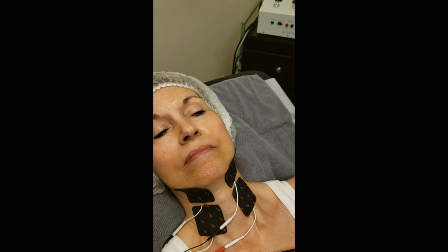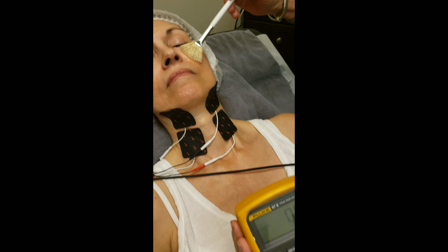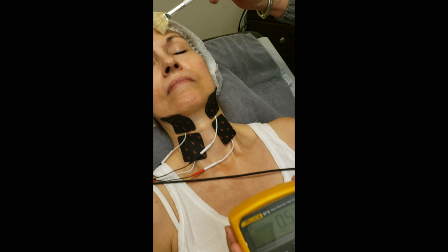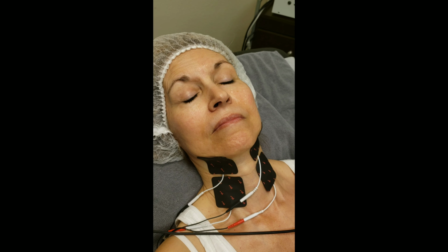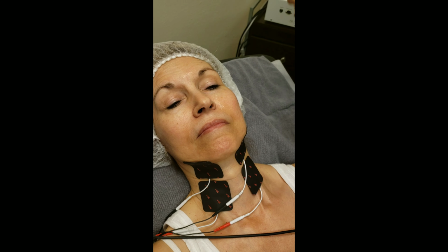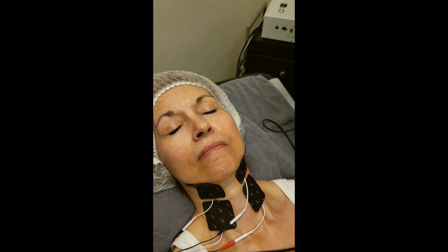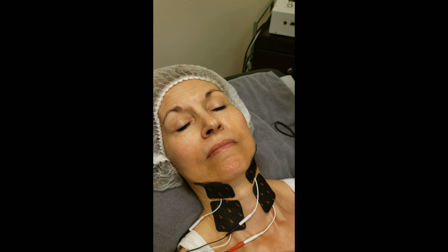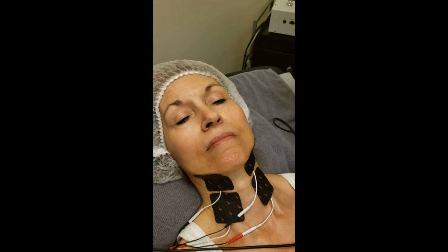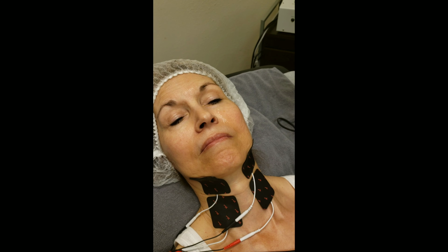Of course, you're going to want to place a little conductive gel on the skin so we can see how the meter is going to react to that. Because right now the current is being delivered through the face pads that are on the skin. So how much available current do we have left that could be used for the probes? This is why when a device monitors skin impedance, it's very important that it can make adjustments based on the amount of surface area being treated.